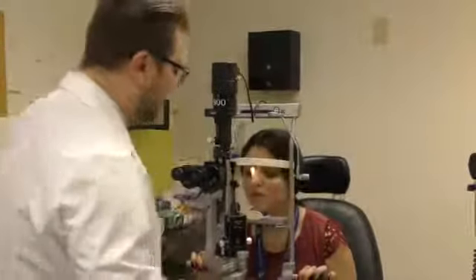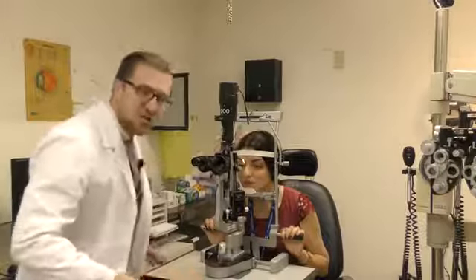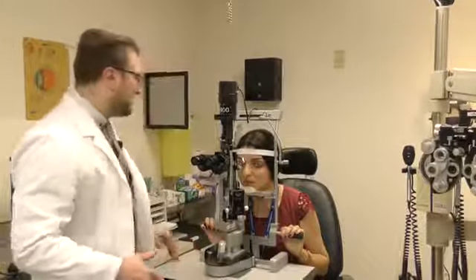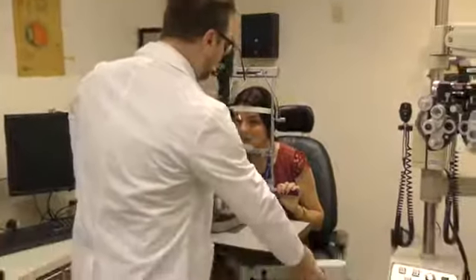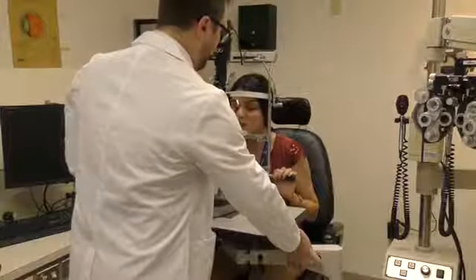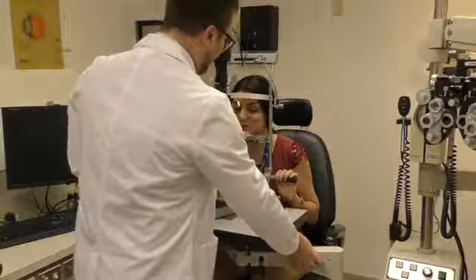And so here I can see, just on initial examination, as I bring it in, she's slouching, her neck is flexed, so I want to make sure she's more comfortable. So what I can do is just adjust the arm. So I'm going to bring it up. I can see now, how are you? More comfortable now? A bit too high. A bit too high. So let's go down a bit, no problem.